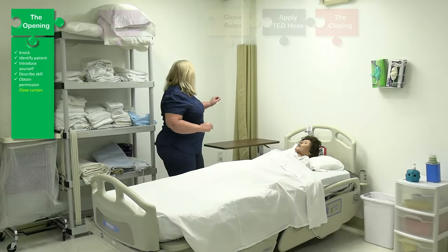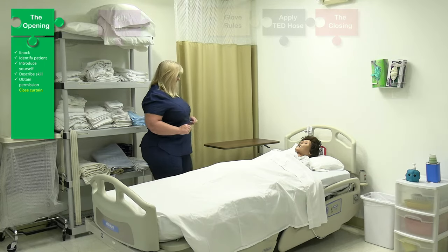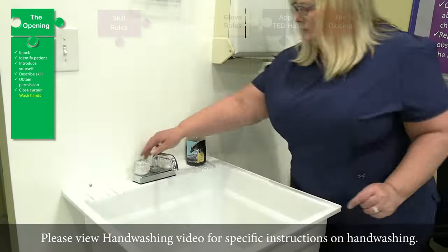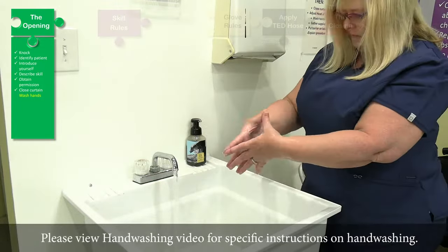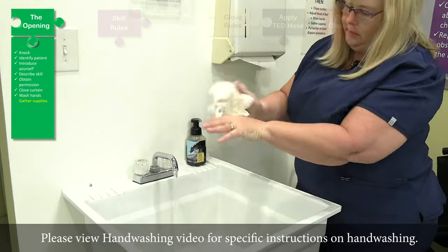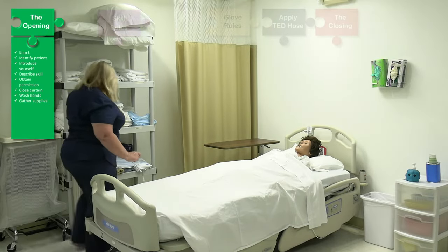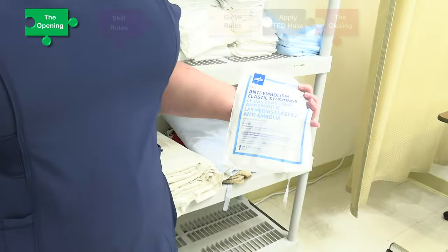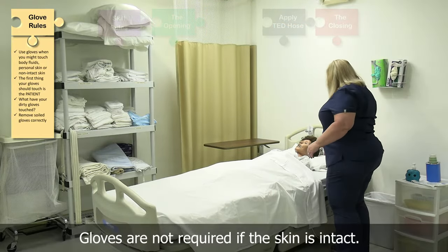Okay, I'm going to close your curtain. Let me go wash my hands, get my supplies, and I'll be right back. Okay, Mrs. Jones, I'm just going to gather my supplies here, and I'm going to make sure the bed is locked for safety.